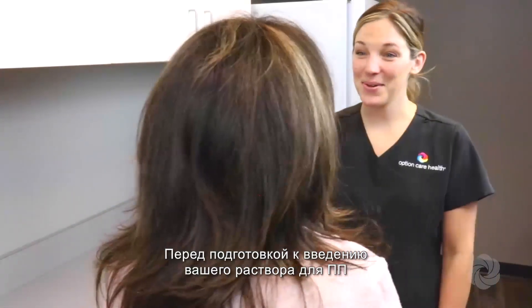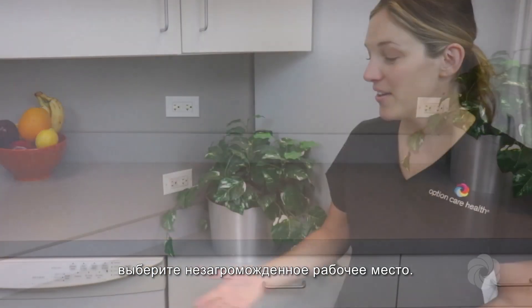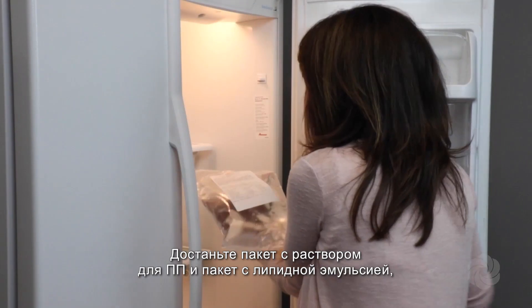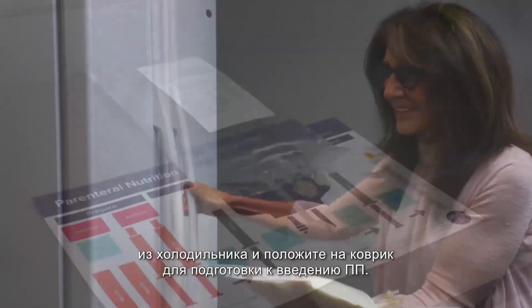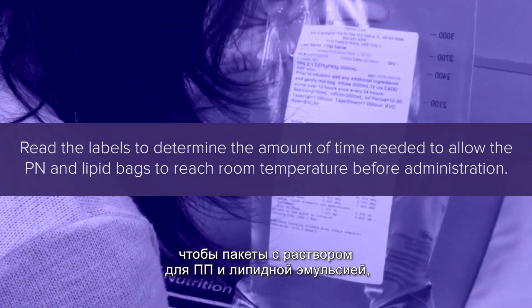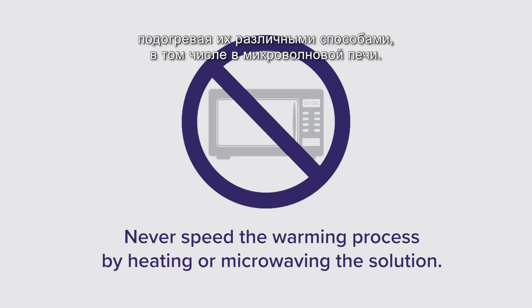Prior to preparing your PN solution for administration, select an uncluttered work area. Clean the work area with warm soapy water or an antimicrobial cleaning agent. Remove both the PN and lipid bag from the refrigerator and place on the PN preparation mat. Read the labels to determine the amount of time needed to allow the PN and lipid bags to reach room temperature before administration. Never speed the warming process by heating or microwaving the solution.